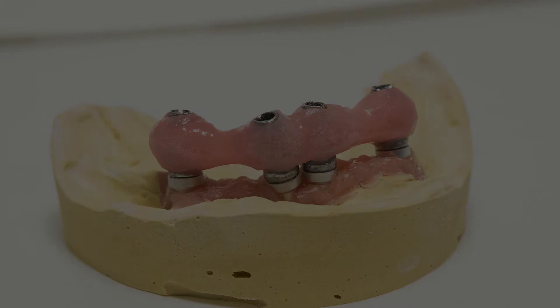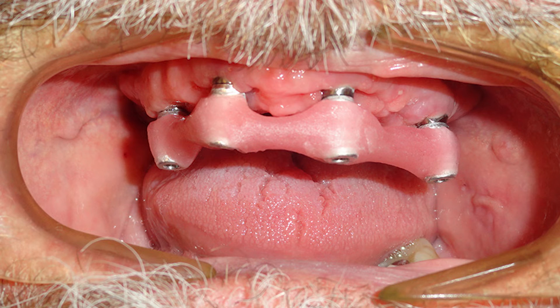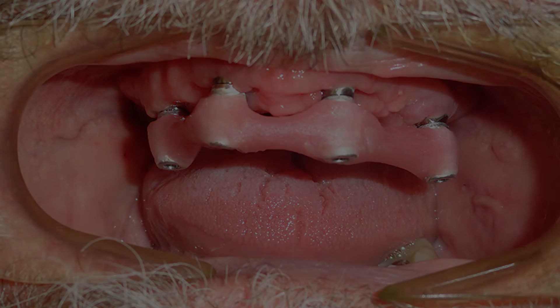Seat the verification jig on implants and use the Sheffield test to ensure the passivity of the jig. Tighten one screw on either end of the jig. Check to make sure the jig is seated passively on the remaining implants. If the jig is not passive, section the jig where necessary. Make sure each temporary cylinder is tightly screwed onto each implant. Lute the jig back together using light cure or resin material. Once material has completely cured, use the provided custom tray to take the final impression.